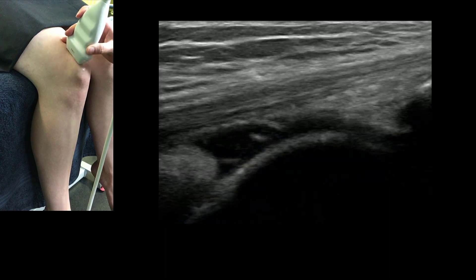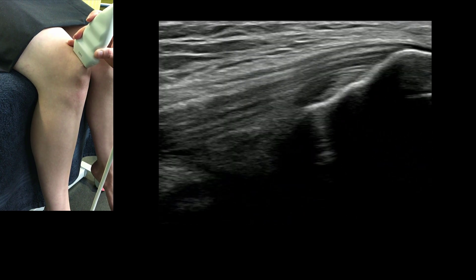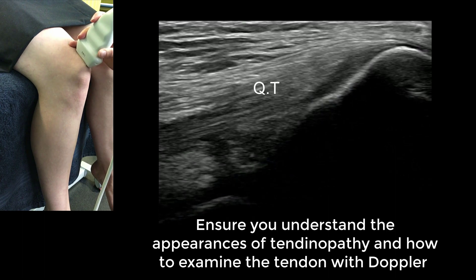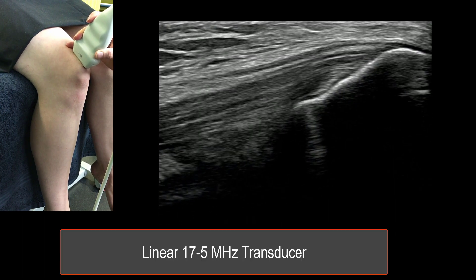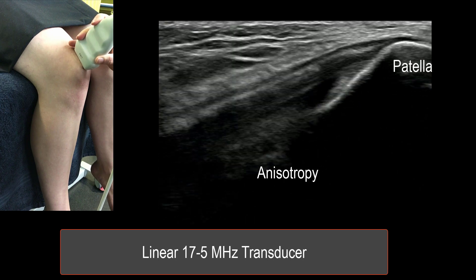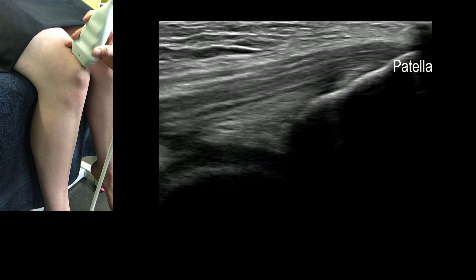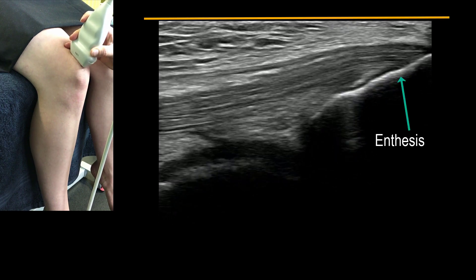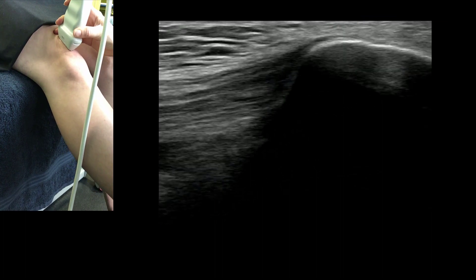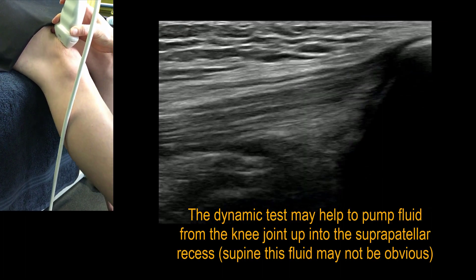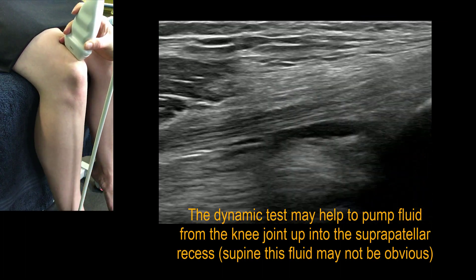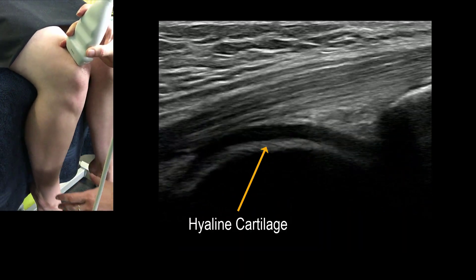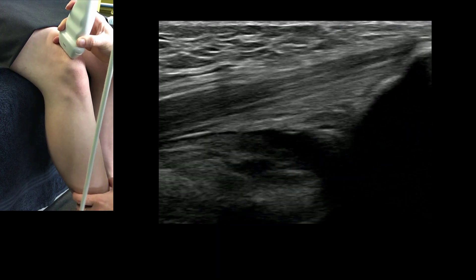Knee 101. We start by looking through the quadriceps tendon moving from medial to lateral — you can see it's multi-pennate. A good image is shown with its surface parallel with the top of the screen. We slowly extend the knee out and then flex it up under the table, which pushes any excess fluid and effusion inside the knee up into the suprapatellar recess.